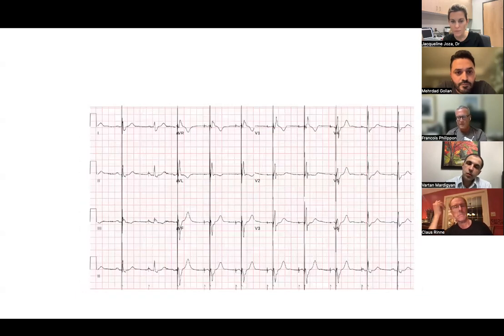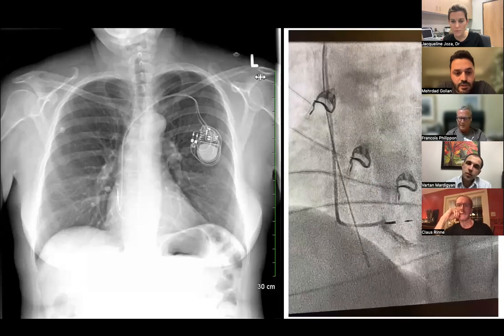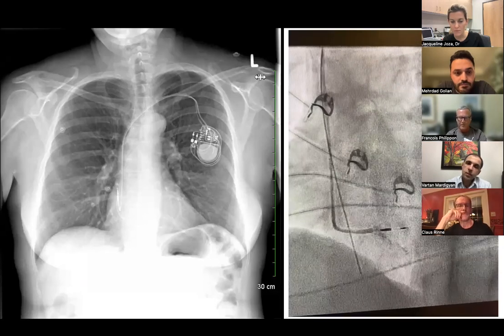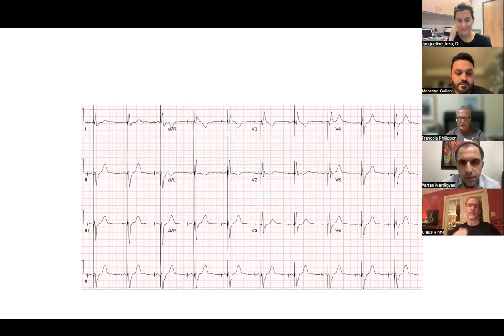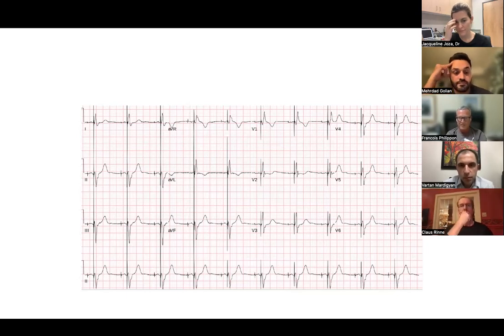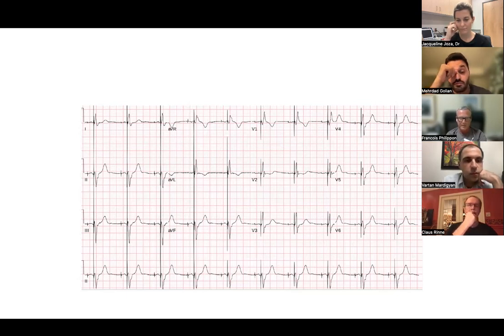Do you think, just looking at your EKG, that you were screwing into the left posterior hemibranch? Because in V6 you have an S wave. It's like a left anterior hemiblock. Sometimes in V6 you have an S wave and kind of a left axis deviation. It's like we just screw more into one of the fascicles than the other. Probably the posterior one in this case, because leads 2 and 3 are negative and you have an S wave in V6. So you're probably screwing into the hemibranch there.